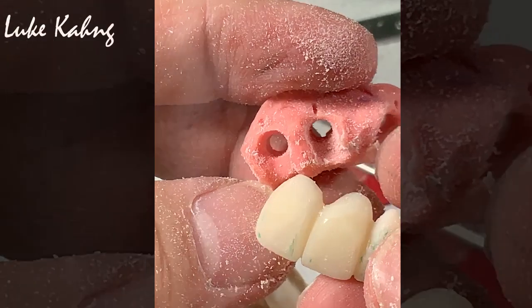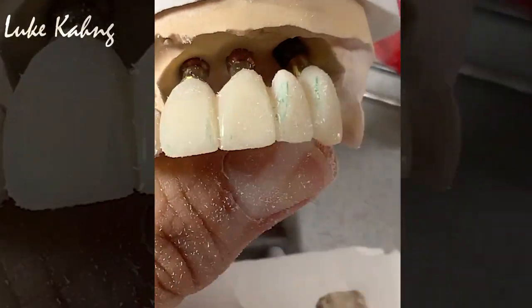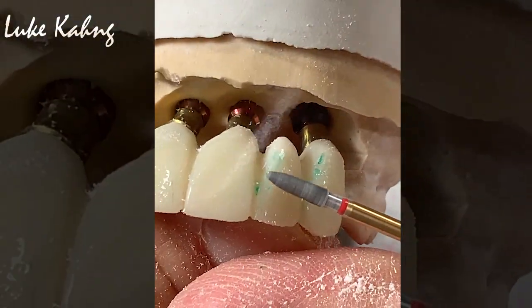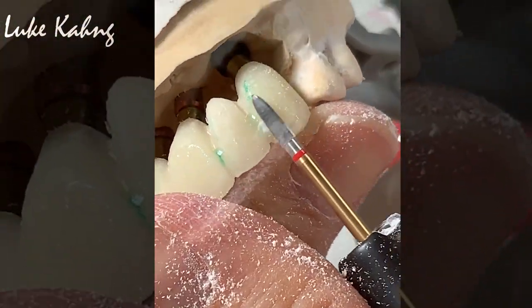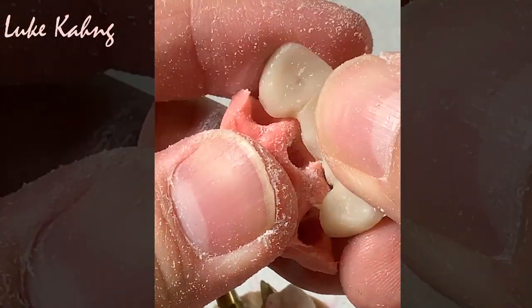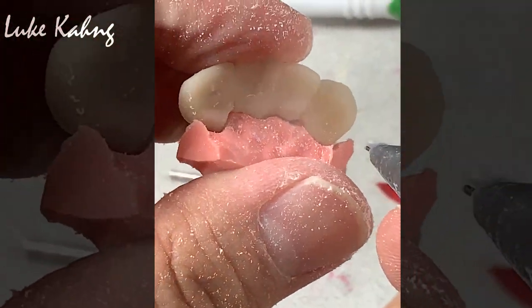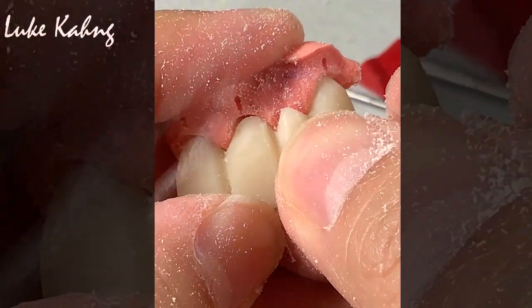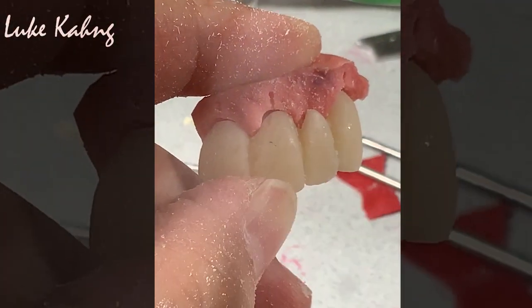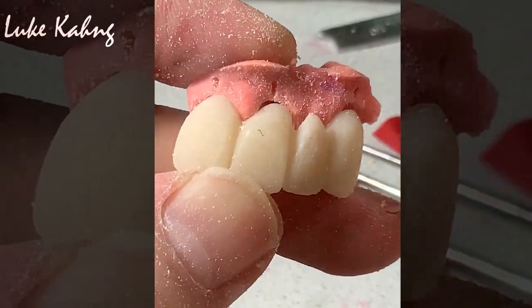So then we don't have any problem, especially whenever I make the contour, right? The 4-unit implant, right? So I can get a better aesthetic, especially this area, you know what I mean? So see, a little bit tight, that area, a bit tight, that area. Right, so it's a little bit tight in between the tooth. So from that, make the better aesthetic.